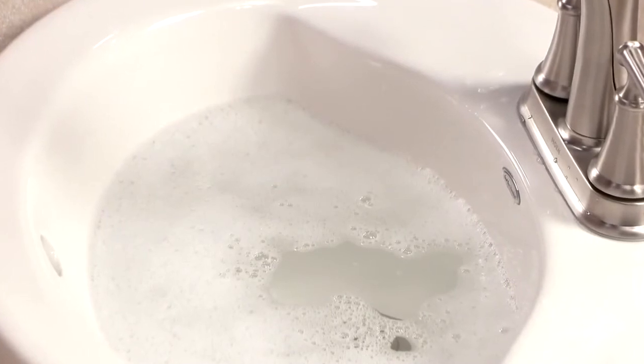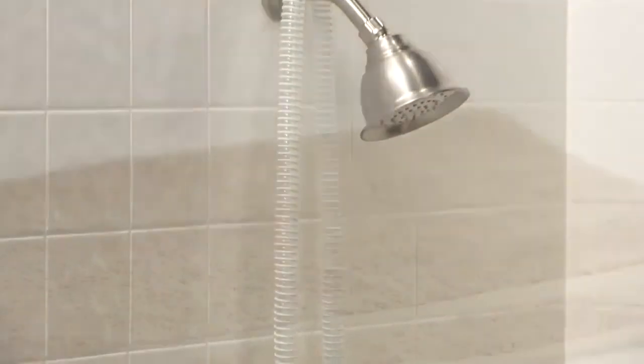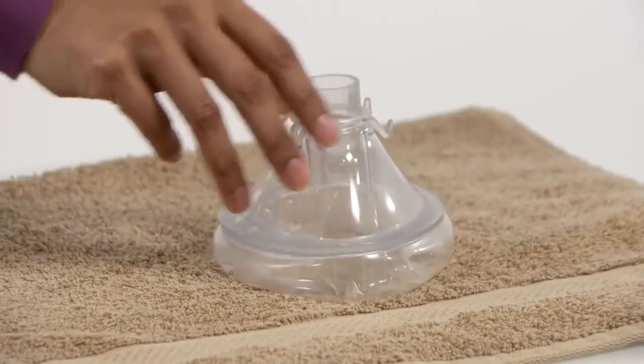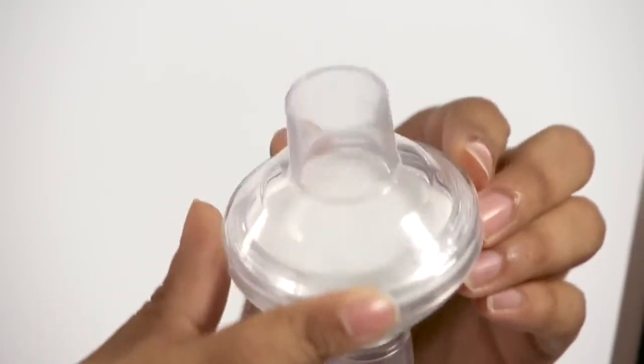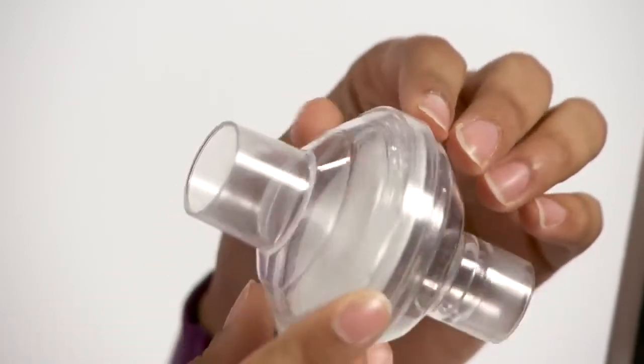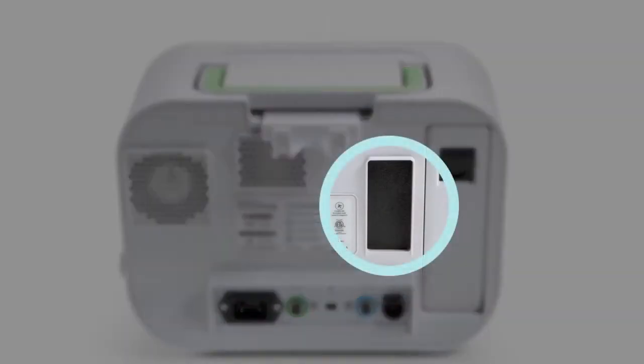It is important to wash the breathing circuit and patient interface with mild liquid detergent and water. The parts must dry completely before next use. The bacteria filter cannot be washed, so you should replace it if it becomes blocked with mucus or trapped moisture. You should clean the air filter at least once every 2 weeks and replace it with a new one every 6 months.